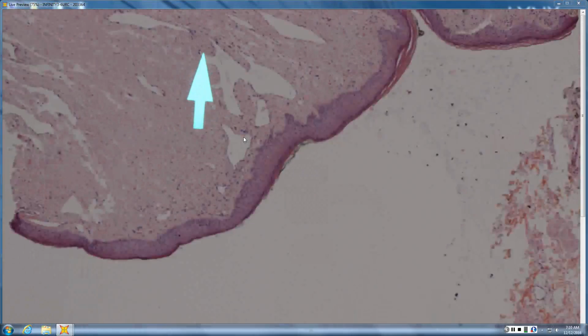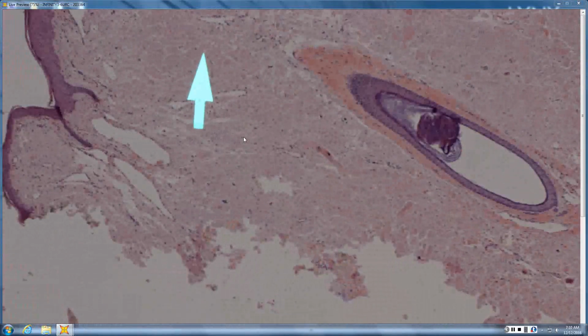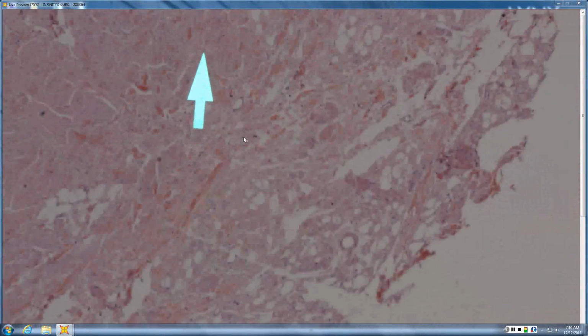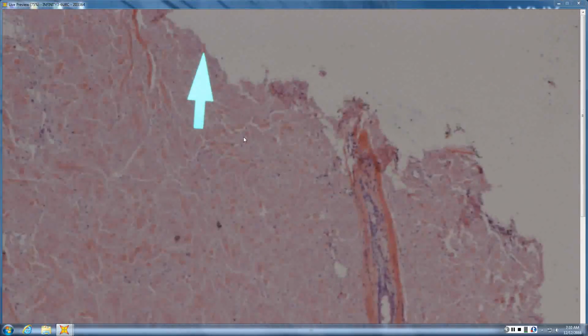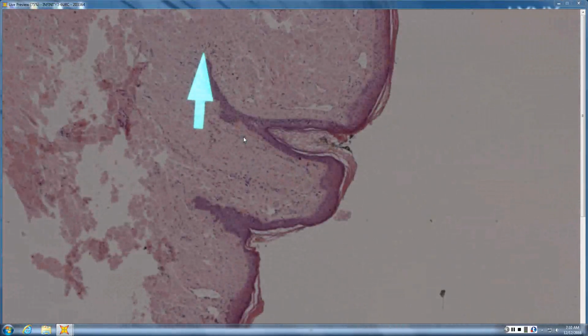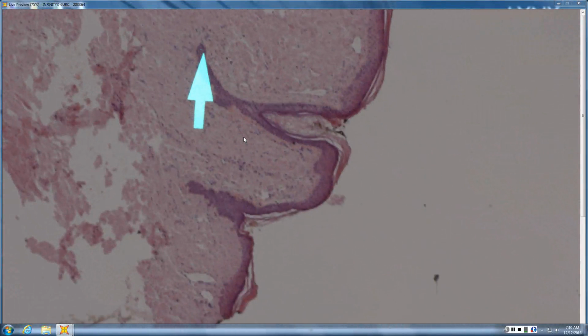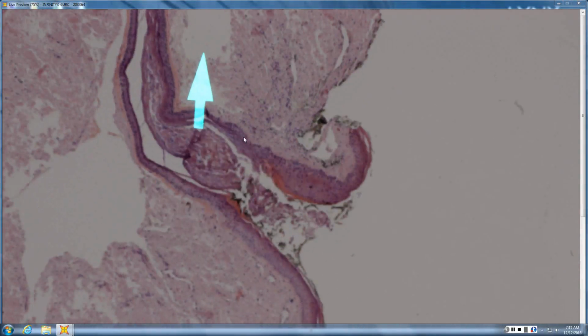But what type gives you that amount of amyloid? Nodular. Good. This one doesn't have really great plasma cell bundles, but sometimes you get them and sometimes you don't. Do you have vertical streaking with amyloid as well, like lipoid proteinosis?